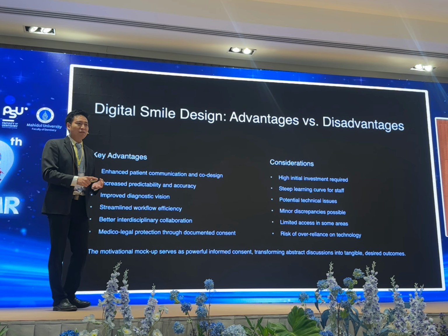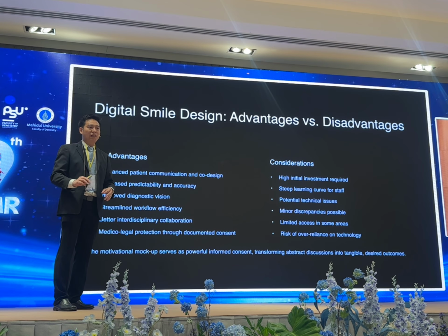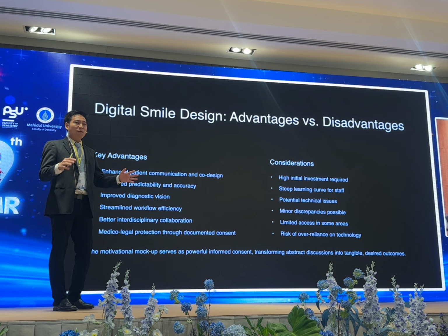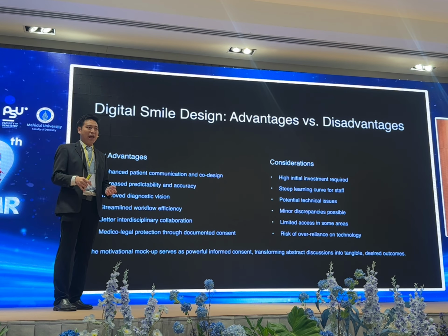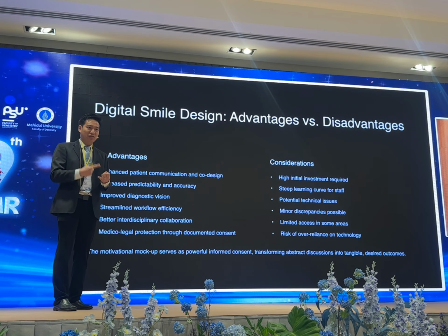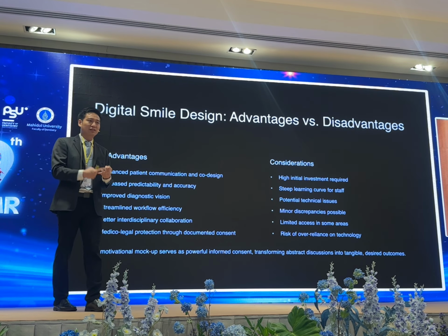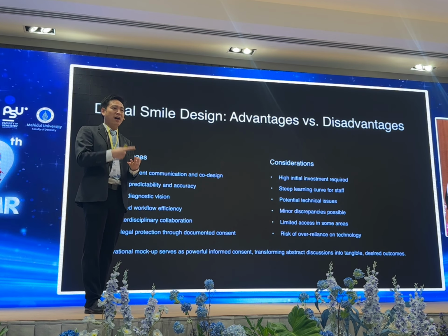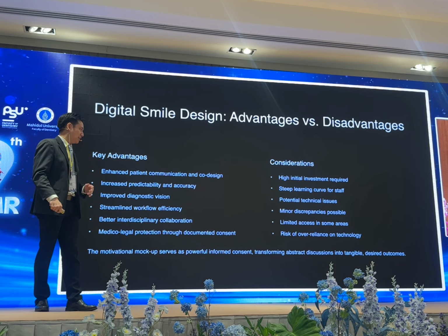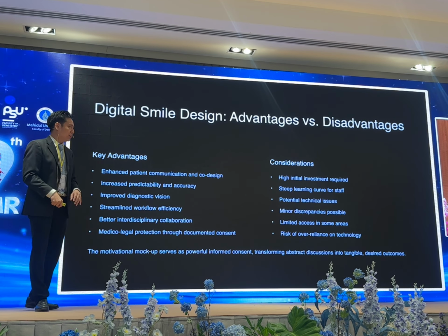And also, a lot of the staff who have worked the conventional way for the rest of their lives, when they want to learn something new, there is a big learning curve. It's not only that you have to learn how to use the technology, you need to understand the basics about the computer, the basics about 3D files, STL, PLY, how to merge and how to manipulate them. So it may not be easy for them to adapt to the new world.